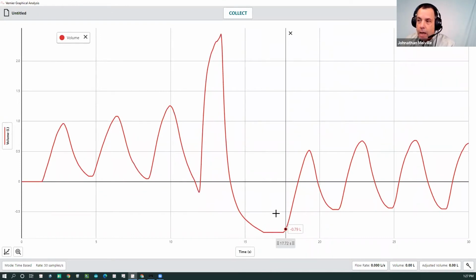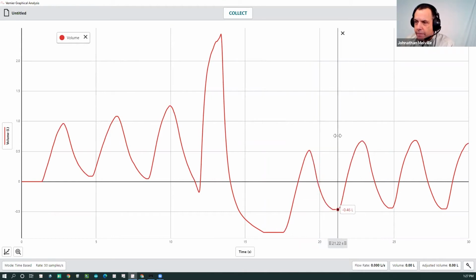All right, and then you could look at the recovery volumes here too, the tidal volumes. You can see that the first recovery breath is bigger, and then these recovery breaths are probably larger than they would normally be on average. That's about half a liter, or they're back up to normal. A little bit higher, but those are recovery breaths.